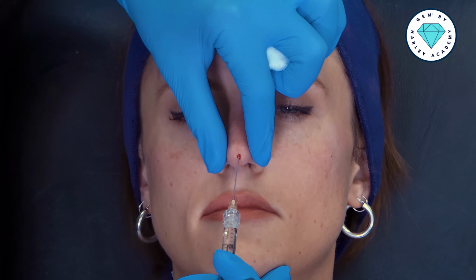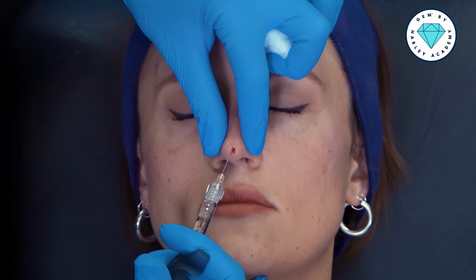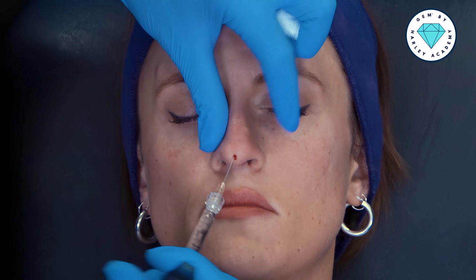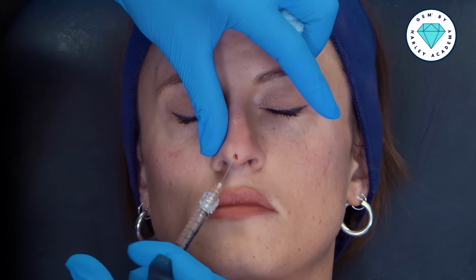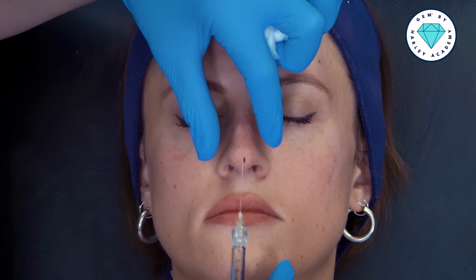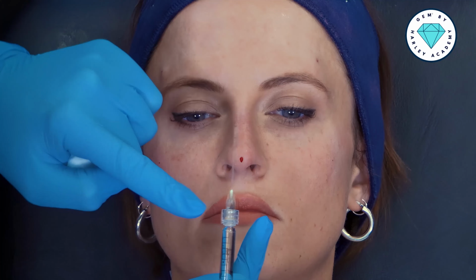And the final thing I'm going to do is create a strip of midline filler down the entirety of the dorsum of the nose, which is going to then give us a very nice light reflex. On camera or in the mirror, there will be a beautiful slim definition to the nose. When I do this, we've got to be careful not to add too much projection at the dorsum again, because that will create another dorsal hump. So I'm going to create the midline definition above and below the dorsal hump, all the way down the nose with the exit port of the cannula facing forwards.